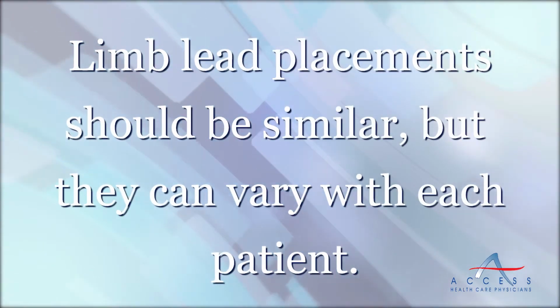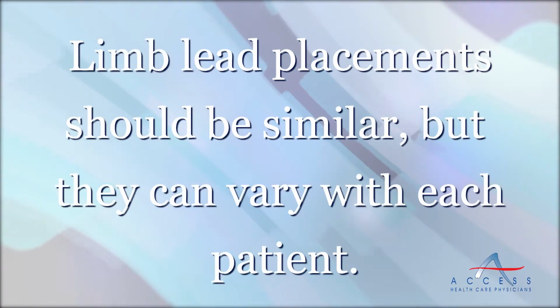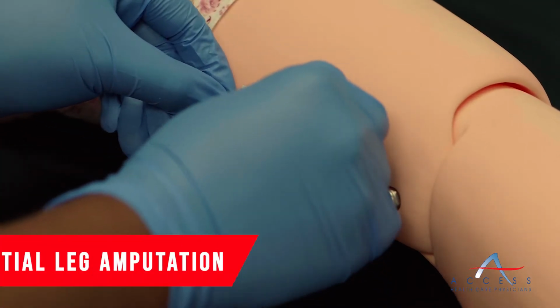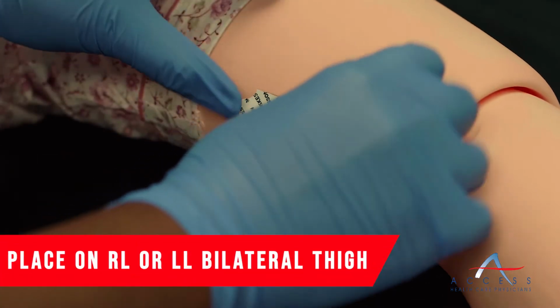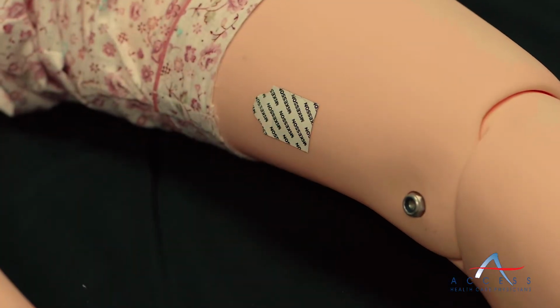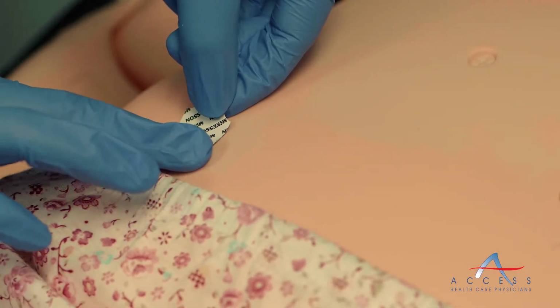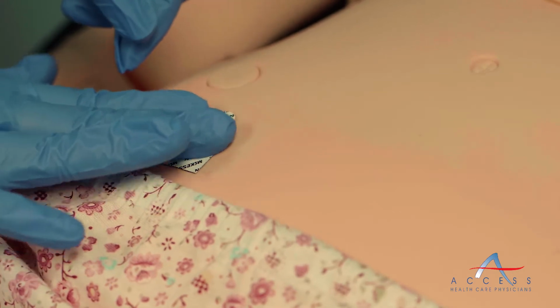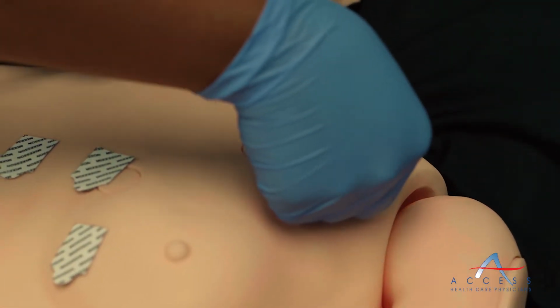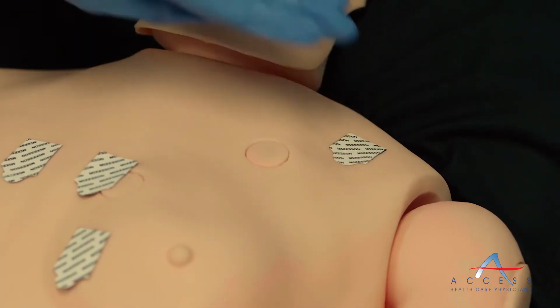Please note that limb lead placements should be uniform, but can vary, especially when encountering amputees. For patients with a below-the-knee or partial leg amputation, the RL and LL electrodes can be placed on the bilateral thighs. For patients with a complete leg amputation, the RL and LL electrodes can be placed on the bilateral lower abdomen. For patients with an arm amputation, the RA and LA electrodes can be placed on the bilateral shoulders.